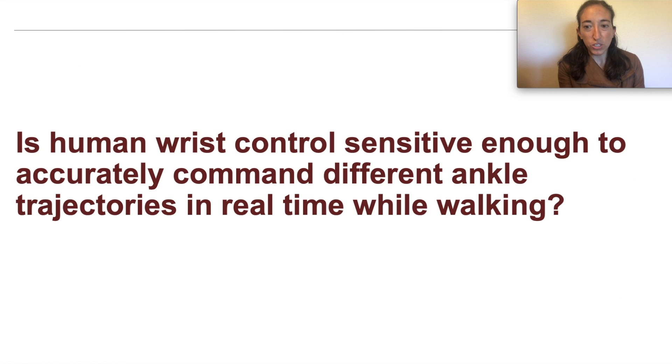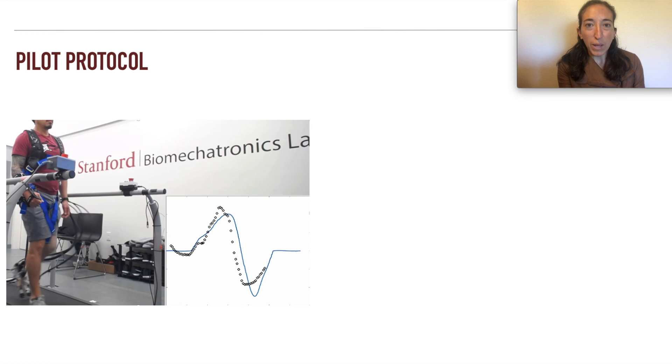One open question was whether human wrist control is sensitive enough to accurately command different ankle trajectories in real time while walking. We brought in one pilot participant to test this question and examine system viability.